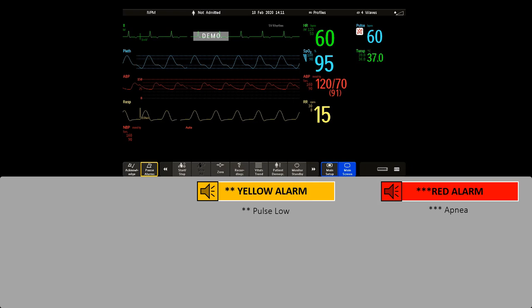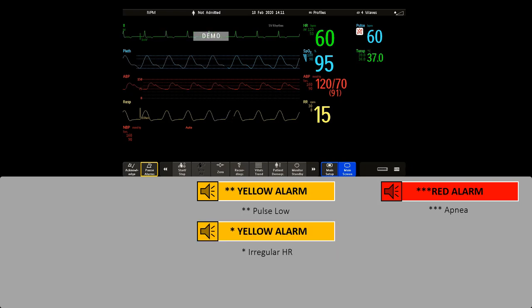A yellow alarm indicates a lower priority patient alarm — take, for example, a pulse alarm limit violation. There are also short yellow alarms. Most of them are specific to arrhythmia-related patient conditions, such as an irregular heart rate or an atrial fibrillation.